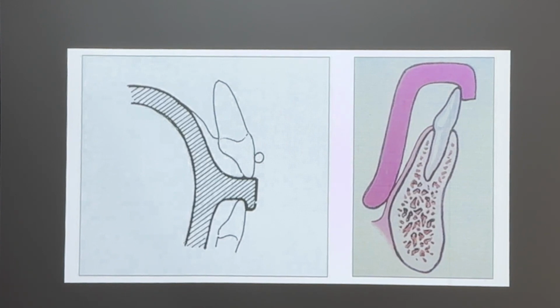So select grinding is a very, very important procedure. But sometimes we cut more. At that time, we need to rebase the functional appliance and start again. Okay? So now I'll tell you about rebasing.